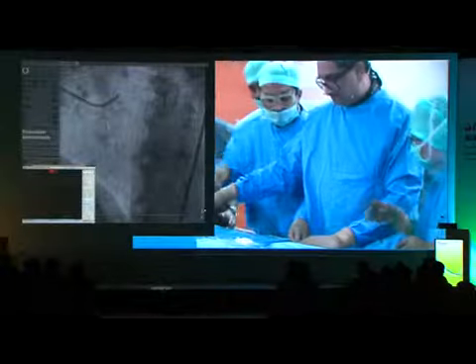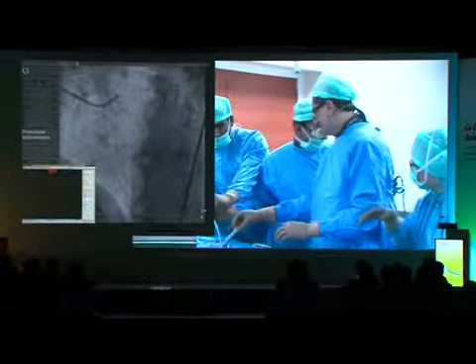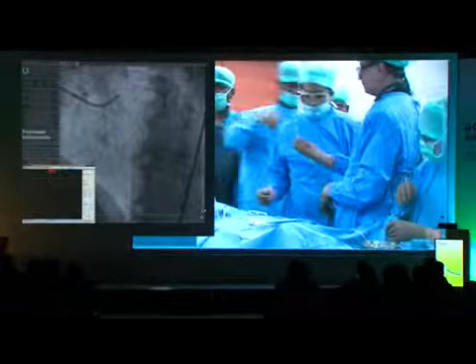Or maybe try a gentle small injection in the catheter. I will take a small contrast syringe with dye. Let's try.